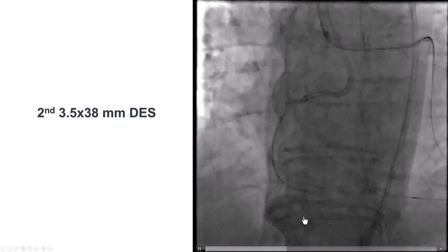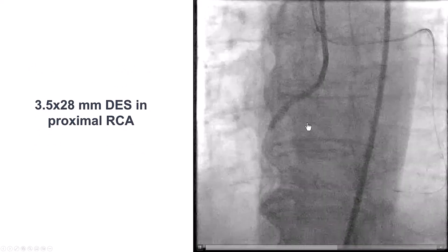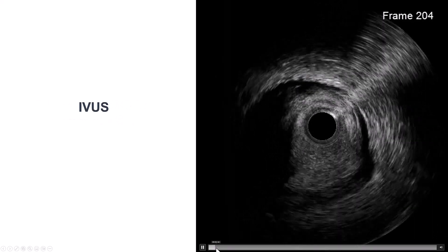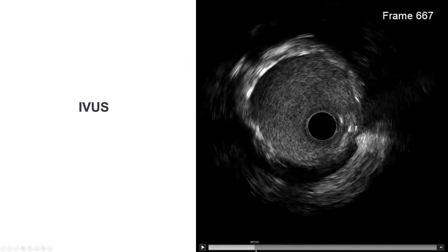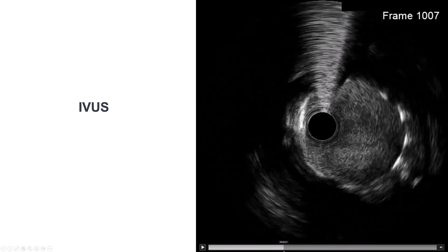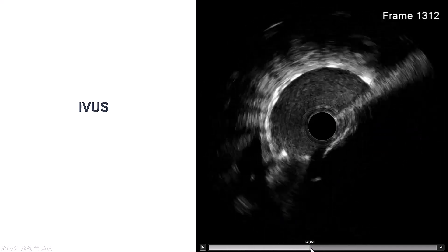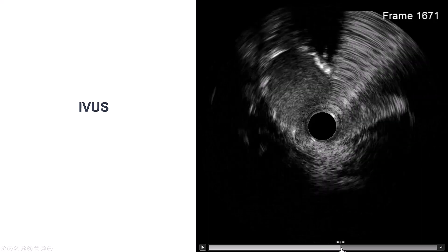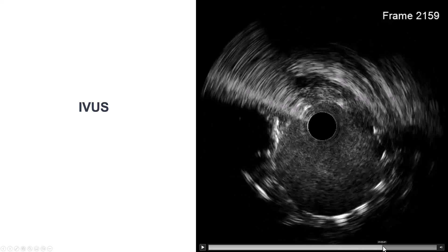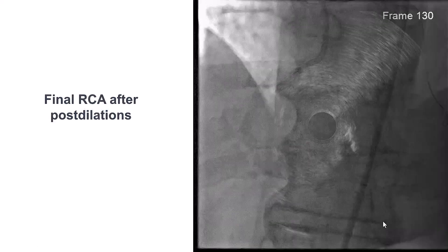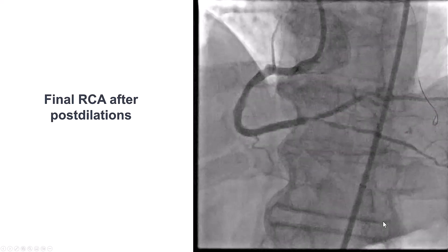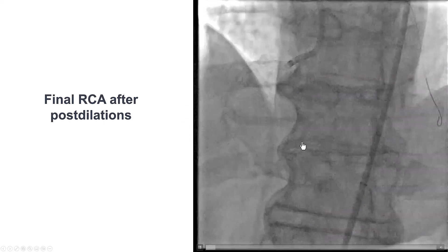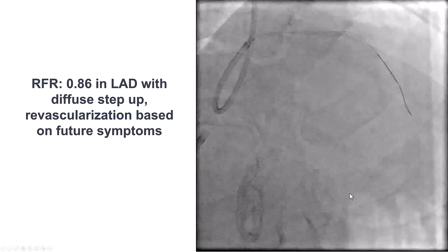We placed a drug-eluting stent distally, overlapped it more proximally with another drug-eluting stent and a third one. We performed intravascular ultrasound given the severe calcification, and we can see that the stent is well expanded — some areas more oval, but overall the area was fairly sizable. The final result showed nice TIMI 3 flow from the RCA all the way to the PDA and the posterolateral branch.